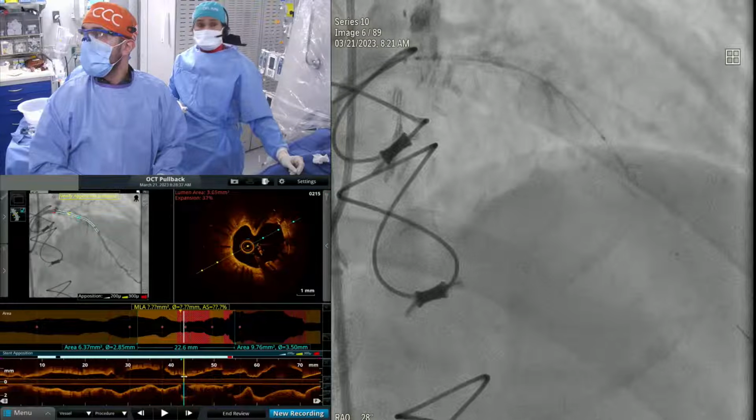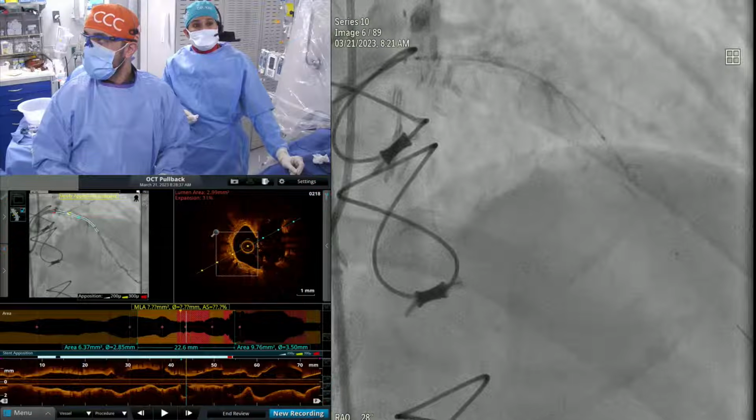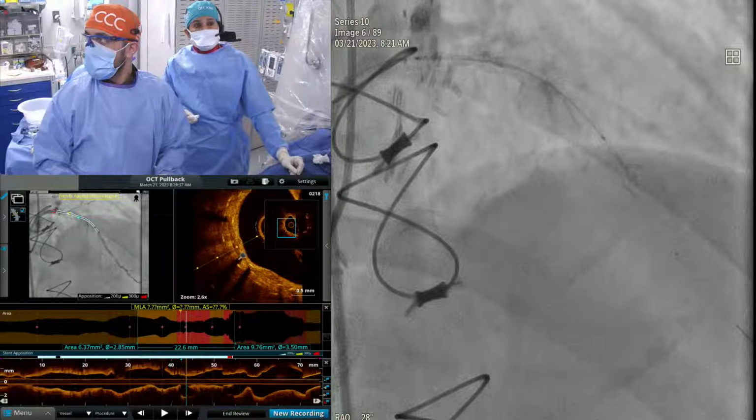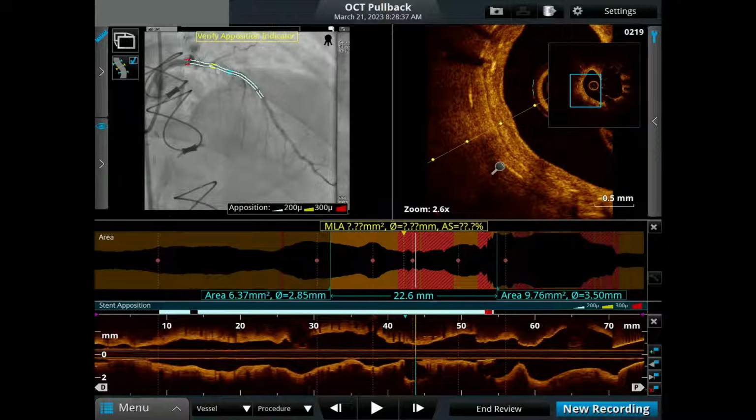Where are the 2 layers? Proximally? So now I see this is the bifurcation part. I magnify. So show that picture, actually this dumbbell. Yeah, see there are 2 stents there. Here is the first layer and the second layer. So it looks like this is a 2 layer.